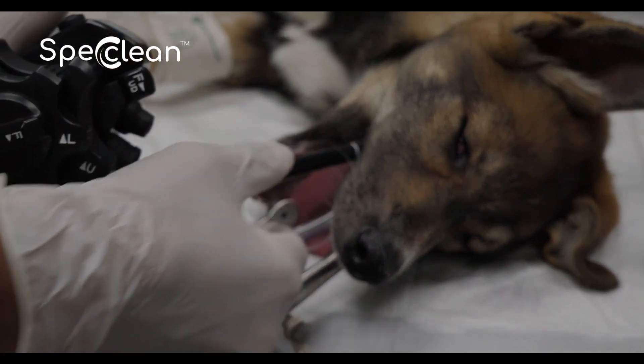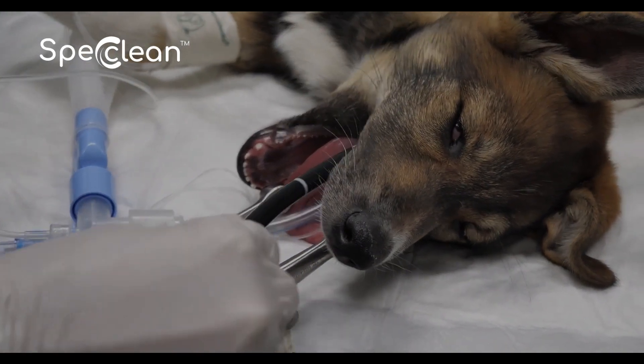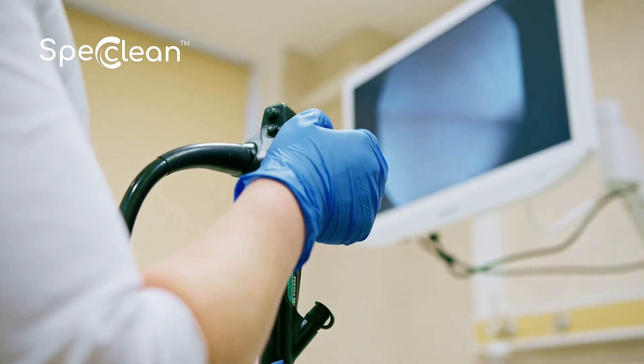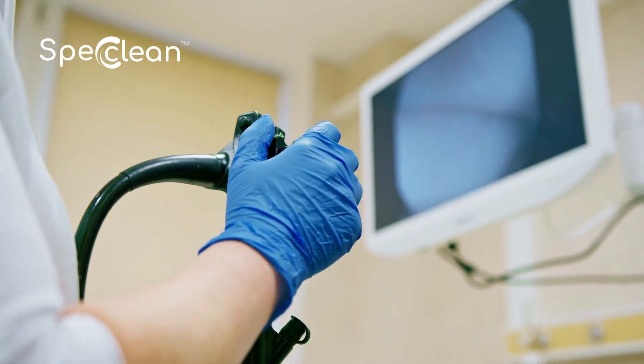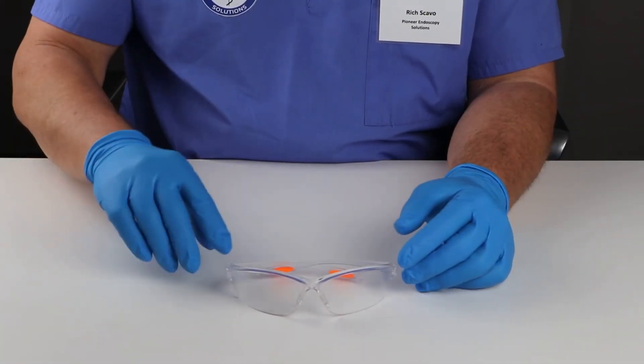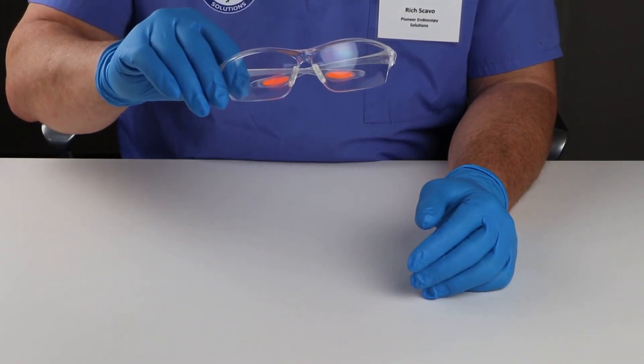First, let's talk about the importance of proper endoscope cleaning. It's not just about hygiene — it's about patient safety and equipment longevity. Improper cleaning can lead to infections, equipment damage, and costly repairs. Always wear proper personal protective equipment to minimize exposure to potentially harmful substances.